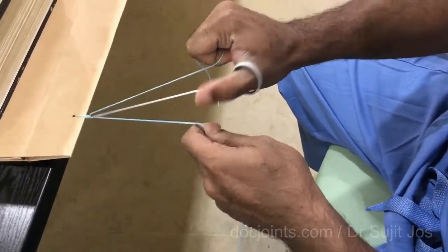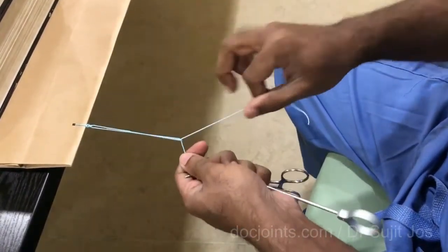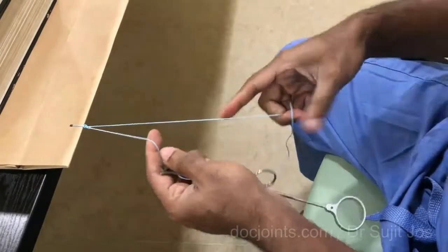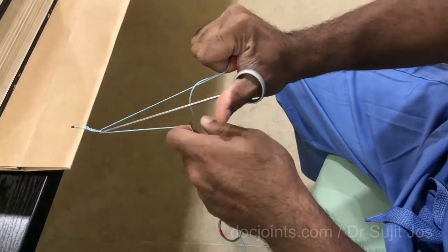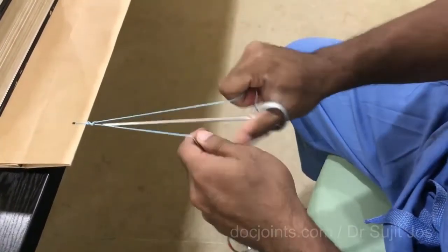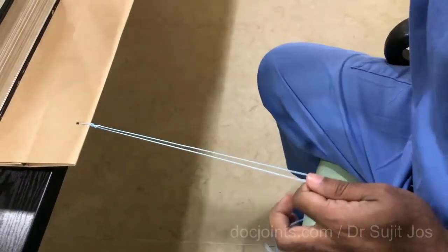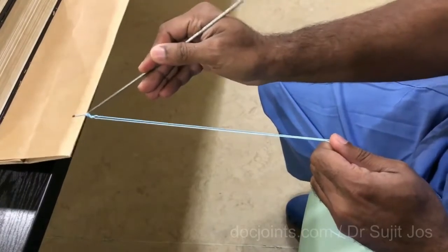One to the left — that is to make a reef knot type configuration so that they won't get loosened later. And one to the right again. The three half hitches in opposite directions. We have the knot which will not get loosened. Now you can take the knot pusher and put the surface away. Even if you pull, the knot is very tight.